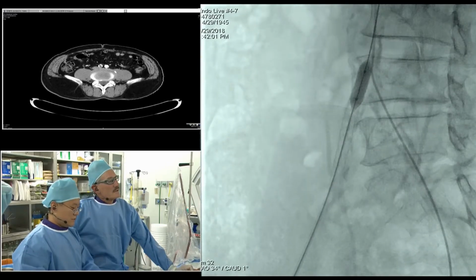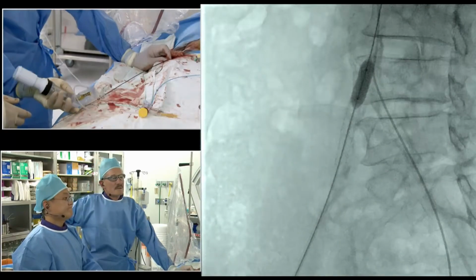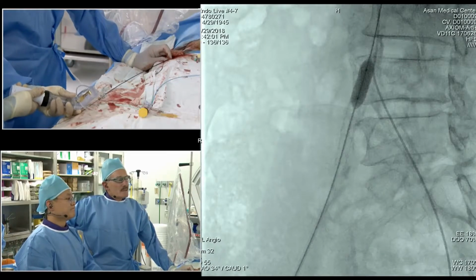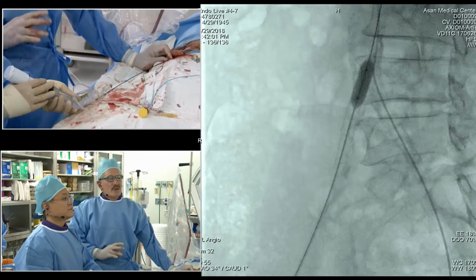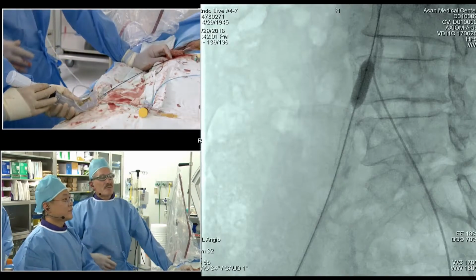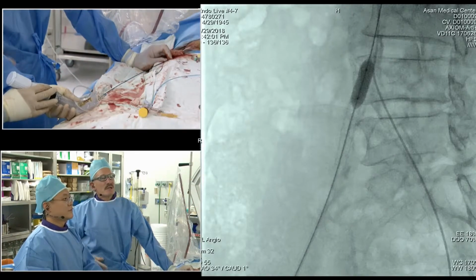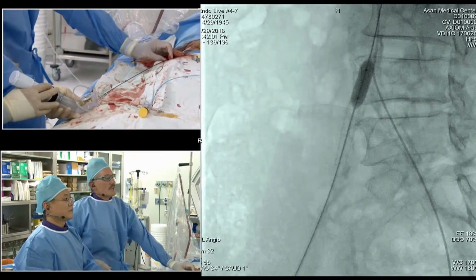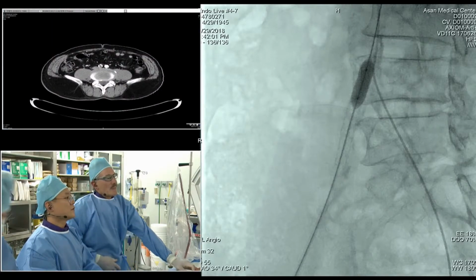How did you pick the length of the covered stent? Because I tried to secure the internal or... So what I did, I can show you, we did an angiogram after dilating the vessel with the 6 millimeter by 60 balloon, with the balloon in place, to estimate length based on the balloon markers. And it was pretty much exactly a 60 millimeter length. We were fortunate we could do this implant with just 1 stent and not have to overlap 2. So we estimated length using balloon markers. It's quite a nice choice.